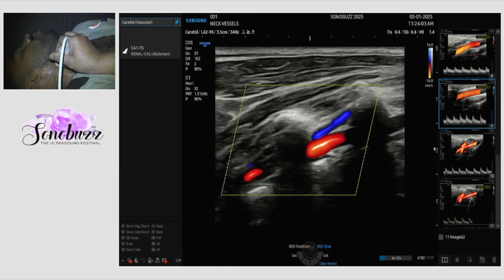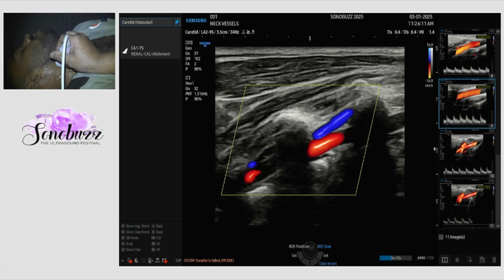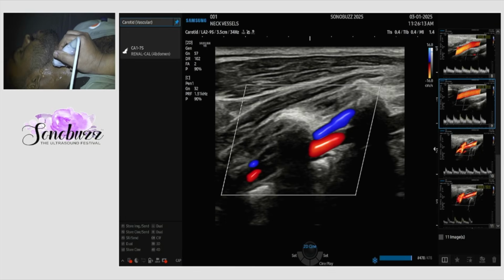Now we are seeing at least two good segments of the vertebral artery and the vertebral vein. Obviously you may have to look at the color of this vertebral artery and vein. Why is it important? Because that would be your first clue towards the vertebral steal, that one has to see that this color, one is red, one is blue. If both are blue or both are red, whatever color bar you are using on the opposite side here, keeping watch on that, we know that this is coming this side towards the probe, so it's blue, and this steering allows me to say this is away from the probe, so this is red. Red and blue gives me a good comfort that there is no steal here.